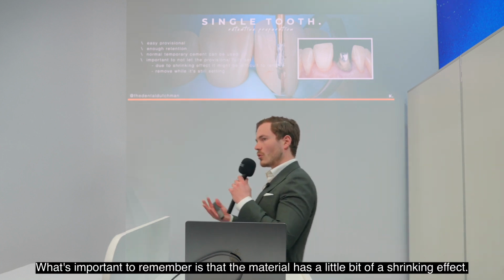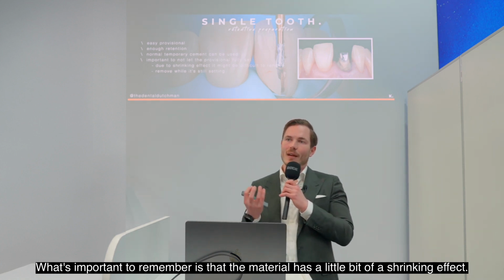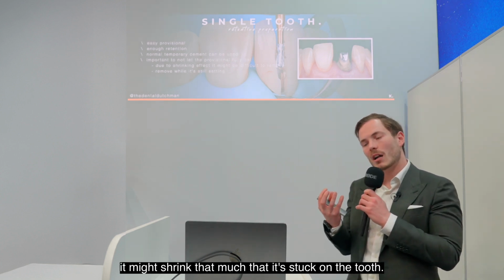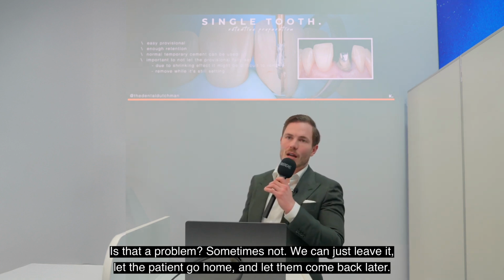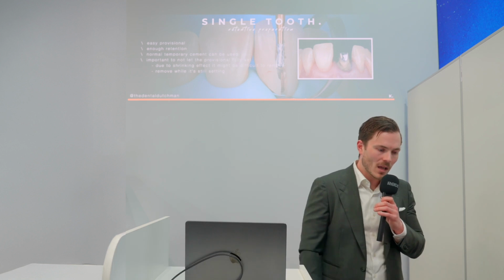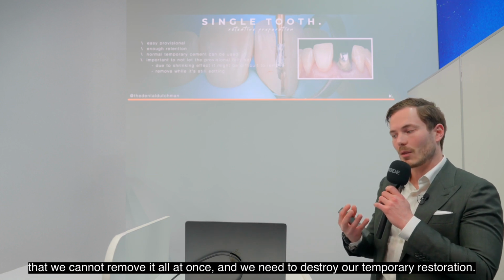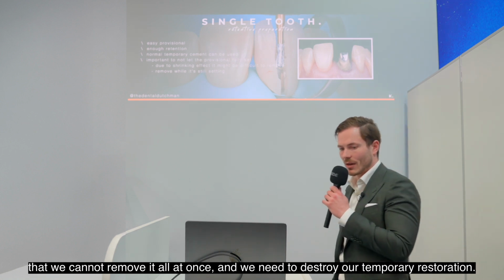What's important to remember is that the material has a little bit of a shrinking effect. So if I let it sit on the tooth for too long, it might shrink so much that it's stuck on the tooth. Is that a problem? Sometimes not. We can just leave it, let the patient go home, and let them come back later. What you genuinely want to do is to remove the temporary restoration, because it might have shrunk too much around the tooth that we cannot remove it all at once and we need to destroy our temporary restoration.